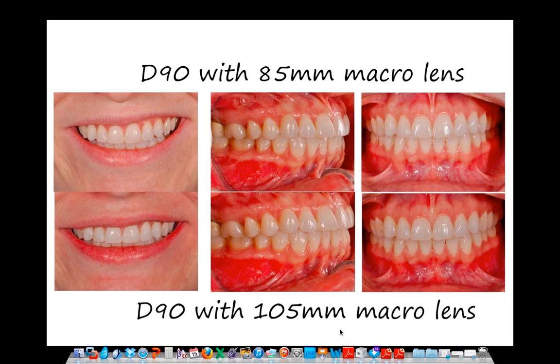If you're not buying from a dental manufacturer like Lester Dine or someone like them who have their own packages, if you're not going through them, buy the same brand. Because if you have a problem, you don't want to start fighting the camera body versus the lens, and neither company wants to take responsibility. If it's all Nikon or all Canon, you send it back to them. It's their problem, not yours.